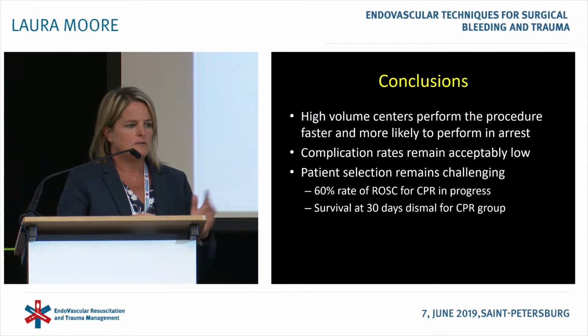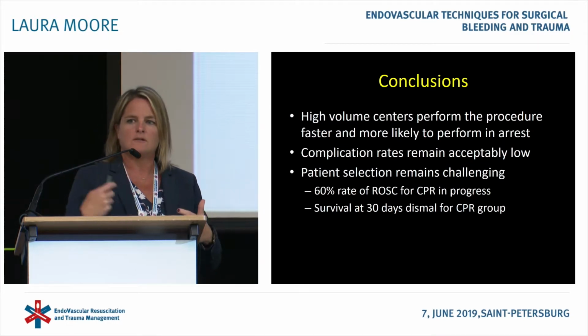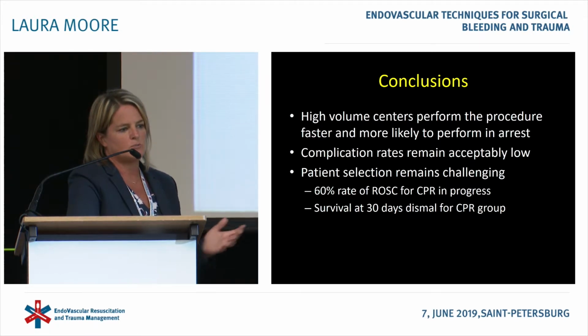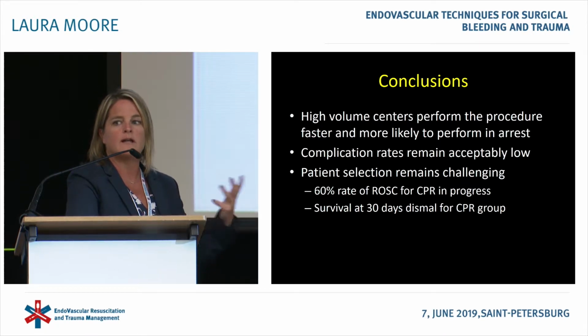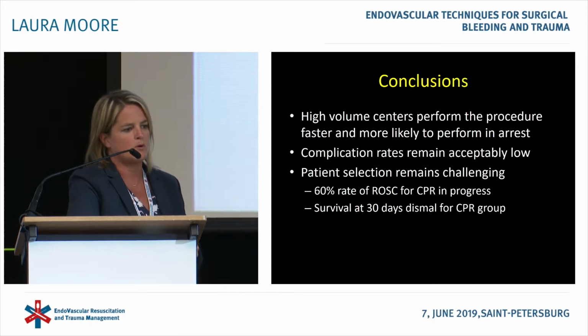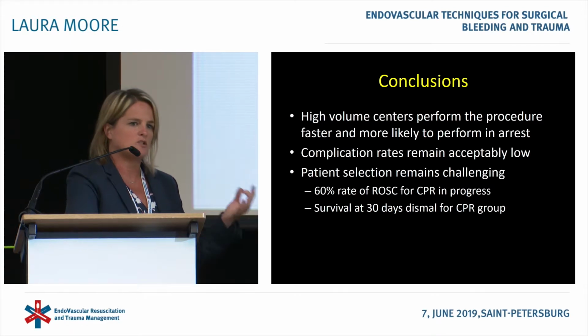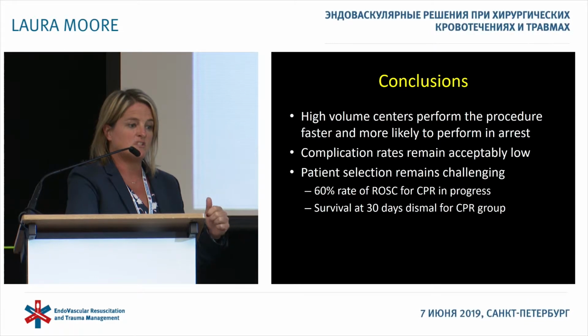In conclusion, high volume centers really predominated here, and we noted a trend towards faster procedural times and a more likely to choose to perform a REBOA in an arrest case. Relatively low complication rates and low device-related issues. And again, I think some of the patient selection is still challenging. We had a 60% rate of ROSC for patients in CPR, but most of those patients did not survive to hospital discharge.